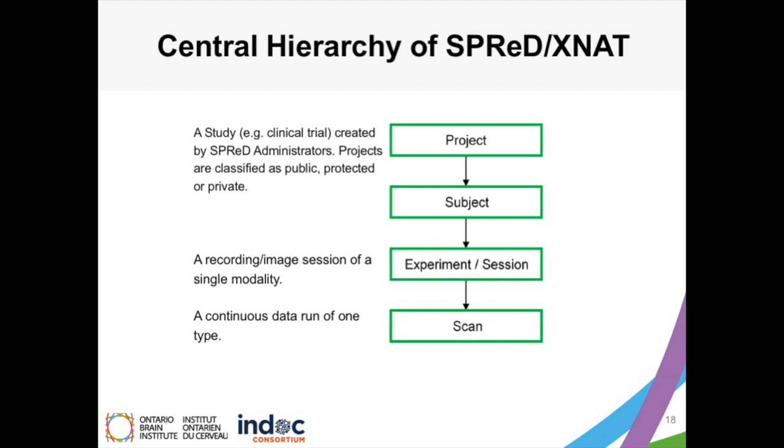Within a project, there are participants labeled as subjects within SPReD. Each subject can have 1 or more experiments/sessions. Experiments are a recording or image session of a single modality. Within each session, there are scans, which are a continuous data run of one type.